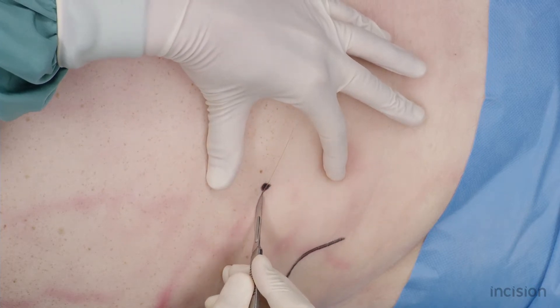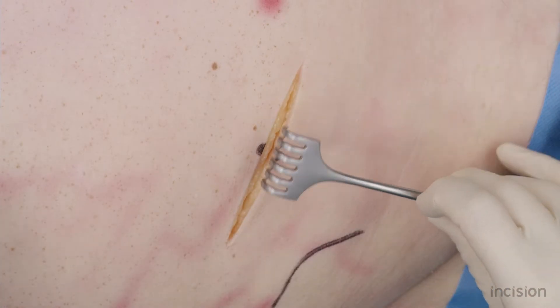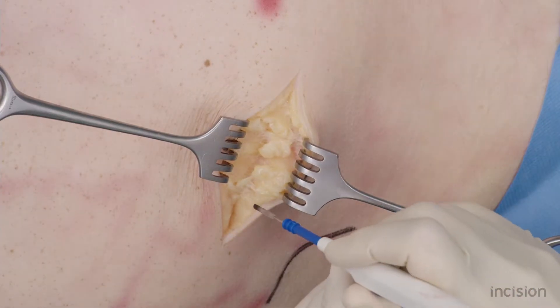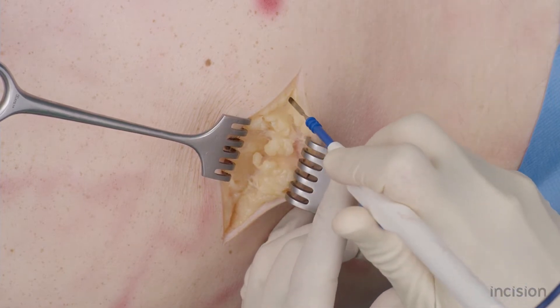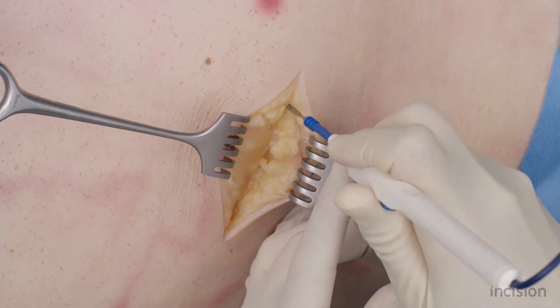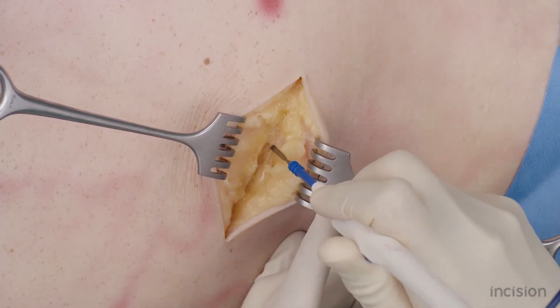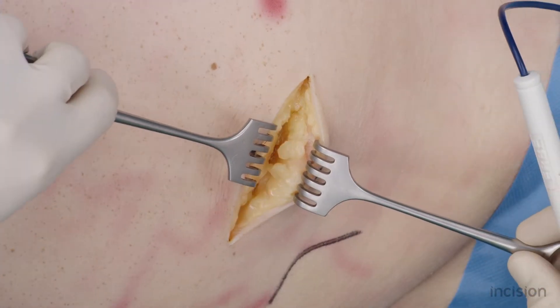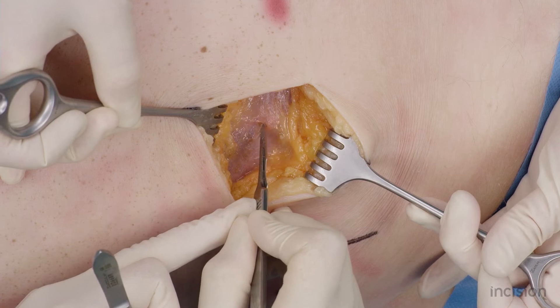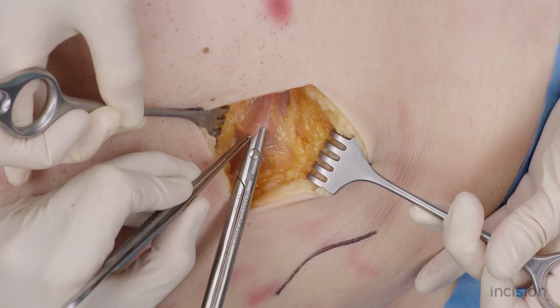For cosmetic reasons, a more lower and lateral incision can be made. Retract the skin with sharp retractors. The subcutaneous tissue is separated with electrocautery until the aponeurosis of the external oblique muscle is reached. Incise the aponeurosis of the external oblique muscle along the direction of its fibers.